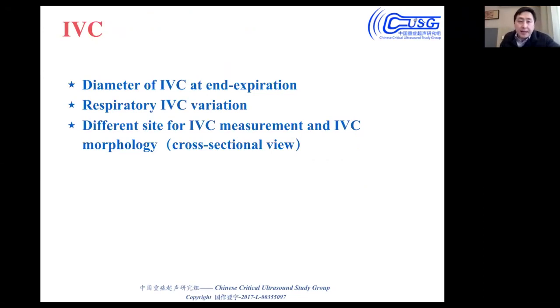And the next step, we go to IVC assessment. We will assess the diameter of the IVC at the end of expiration, and we see the respiratory IVC variation to assess fluid responsiveness.